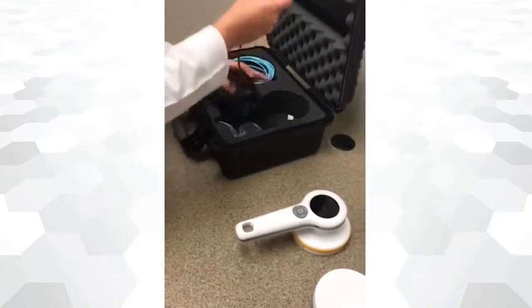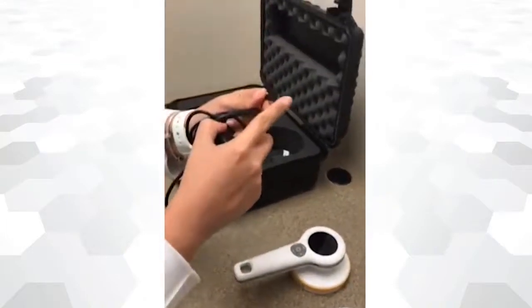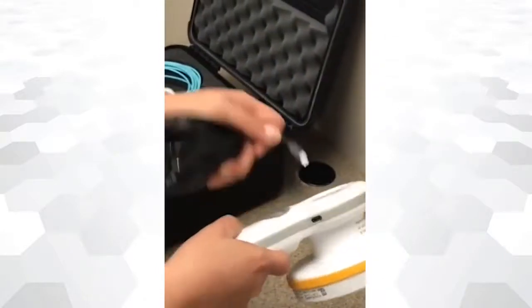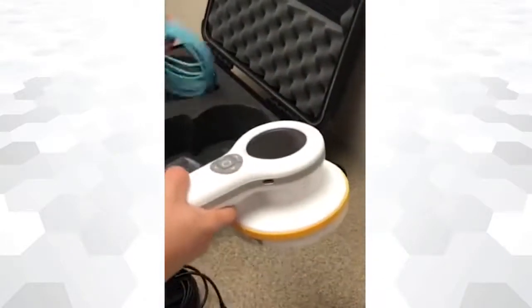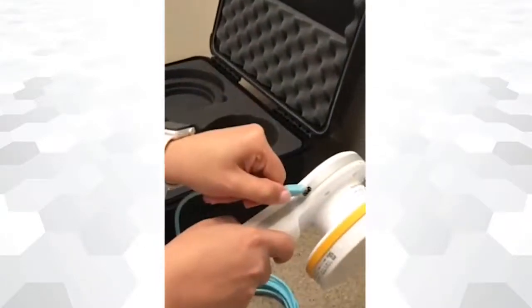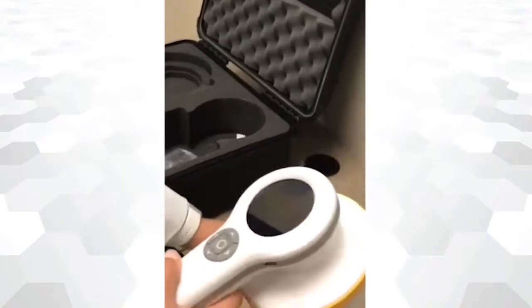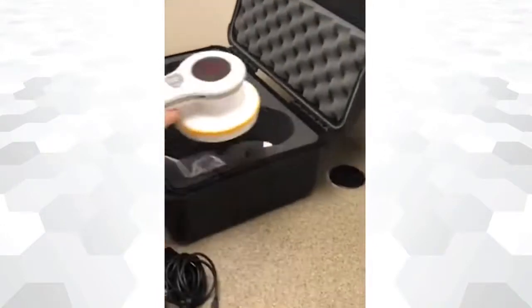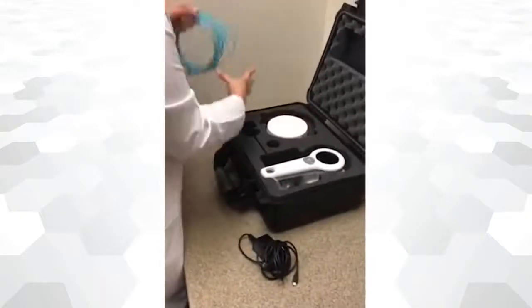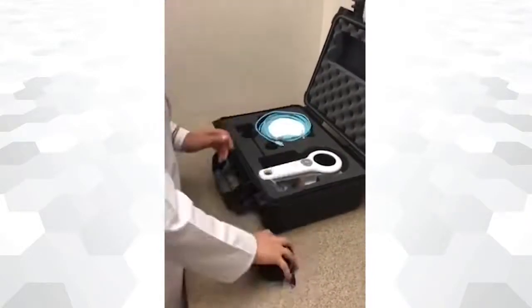RACE-A 452 can be recharged using a USB connection. The same USB port can be used to plug in a USB cable to access all your recorded data. Always store the device with a lid on to protect the Geiger-Müller metal grid. The device can now be safely stored.